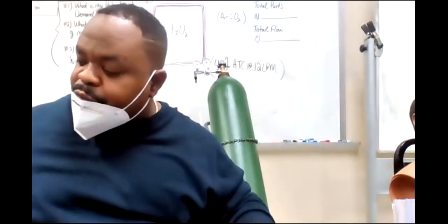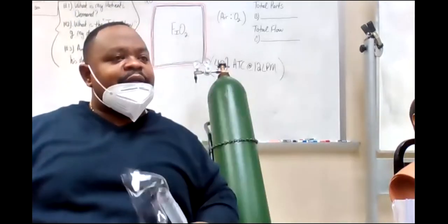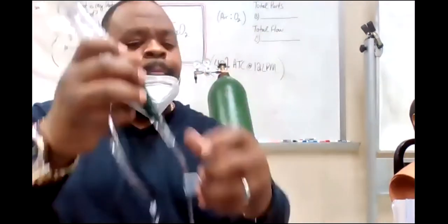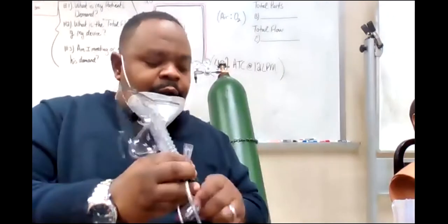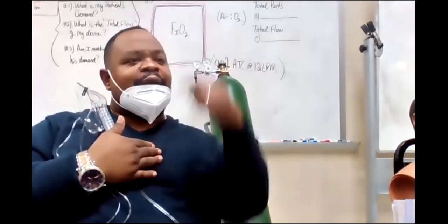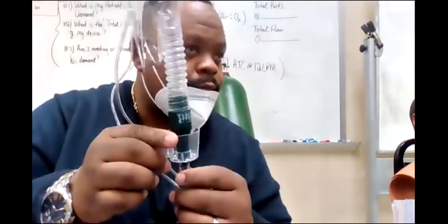Same thing with this Venturi. If I cover this up, I'm getting 100%. That's very dangerous for your COPD-er. You gotta make sure that this, now if this is on there, you still could cover it, but it gives you a little bit more safety, okay? So now if I got my bed sheet laying on it, it's still not completely occluding and I can still suck in some air, okay? That's what this is for.